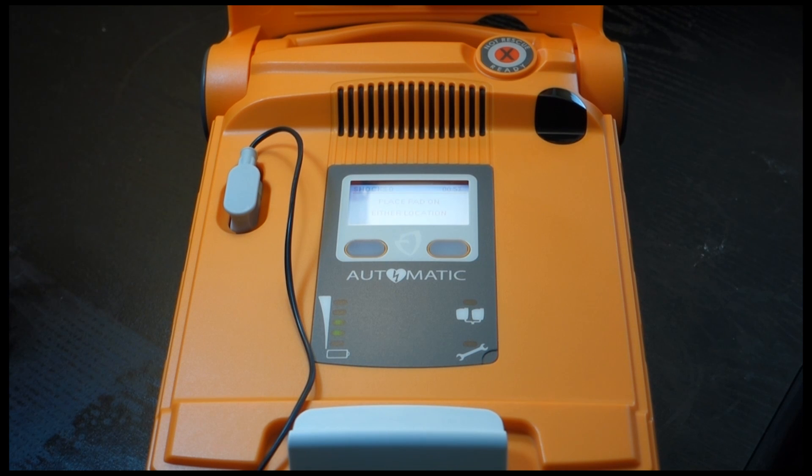This pad can be placed on either of the two locations as shown on the pads. Next, peel the second white pad from the blue plastic. Firmly place the second pad on the other location, exactly as shown on the pads.